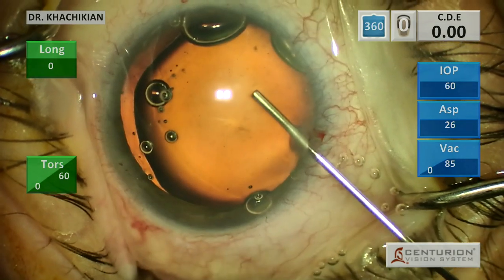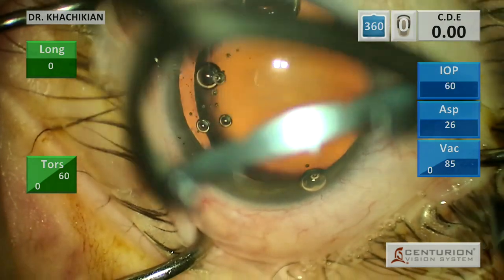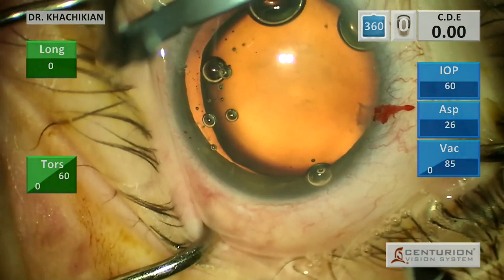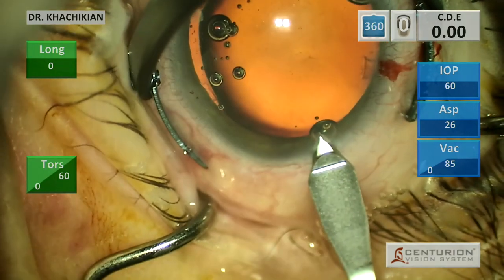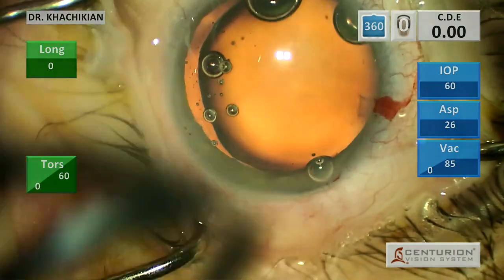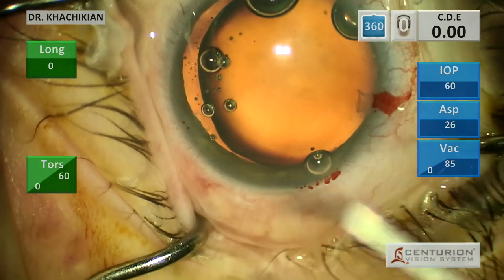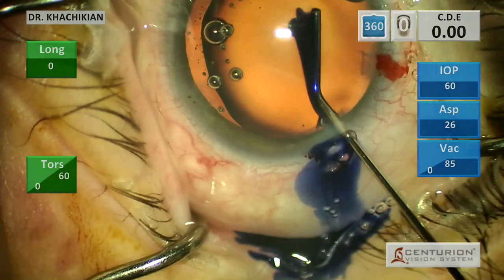You can see the lens is a little bit loose. We put our viscoelastic in and we're going to make our main incision. The lens is somewhat loose - not totally loose - but those zonules clearly are weak, superiorly.